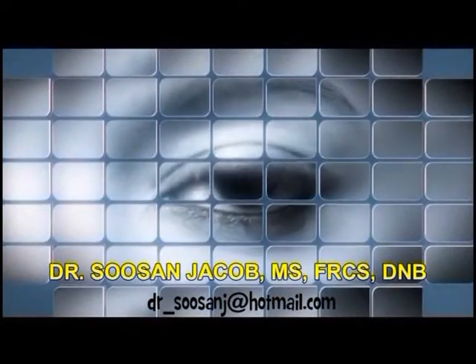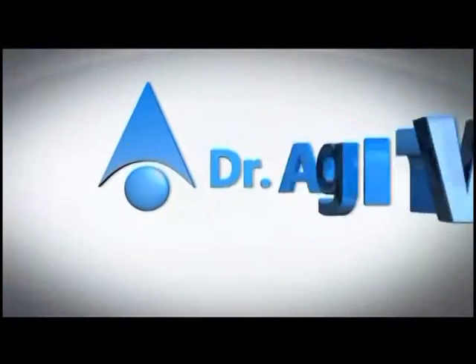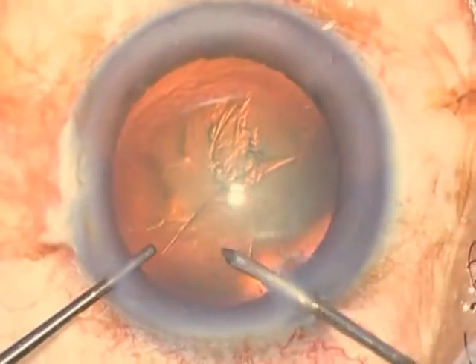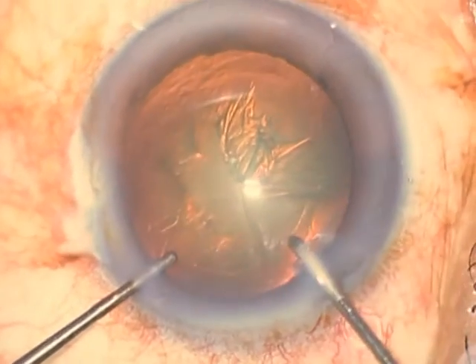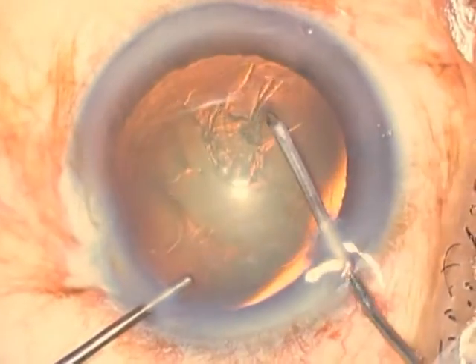Good morning everybody. I'm going to show you how to perform horizontal chopping for nuclear disassembly in phacoemulsification. This is a moderately dense nucleus, and what I'm doing first is to complete my rhexis.